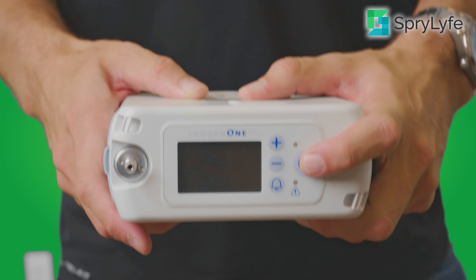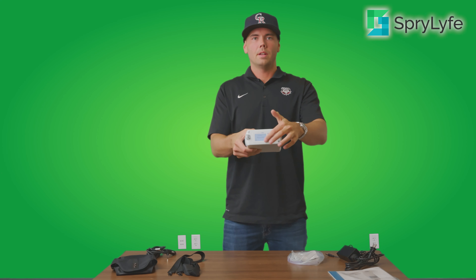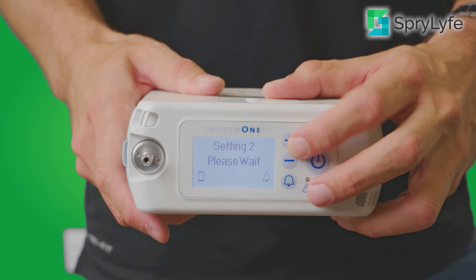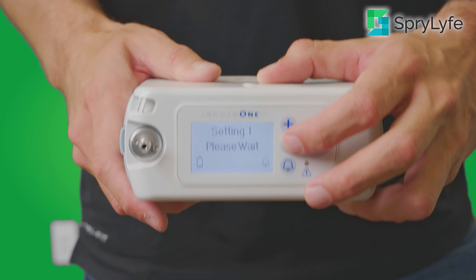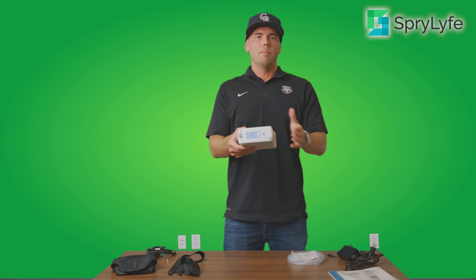To power on and use your Inogen 1 G4, all you're going to do is press down on the power button right here. You're going to hear that beep and the machine is going to start up. On the interface you're going to have a plus and minus button to either increase or decrease the flow settings. Press it once, it'll increase it; press it twice, you'll be up to the setting of three, and you can change that whenever needed. If you want to mute the alarm function, you do have an alarm bell that you can press and hold, which will mute that alarm setting.